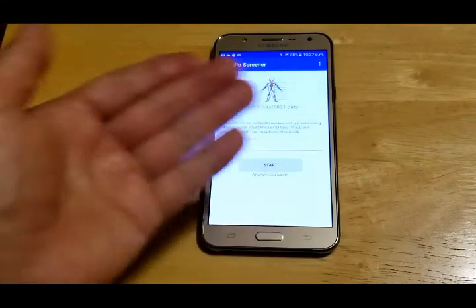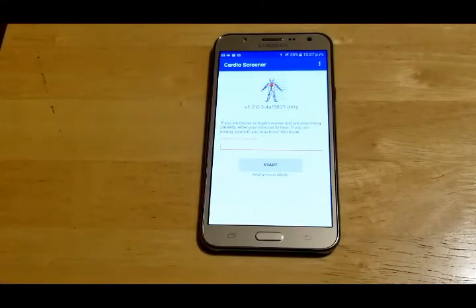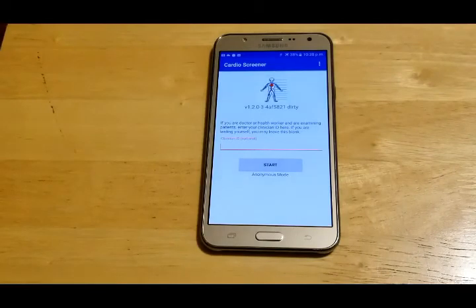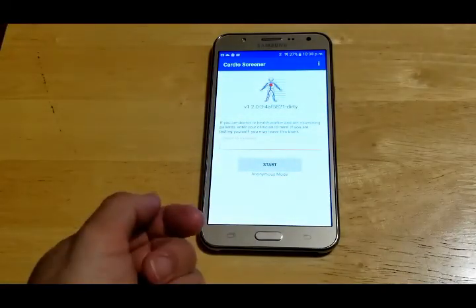So what I have just done is I have completed a measurement on an anonymous patient, an anonymous person, and none of the data is saved, but the only thing that is saved is the overall final results, and that saving is optional. But no information is collected from the patient, so the patient does not need to be registered. So I think that's it.